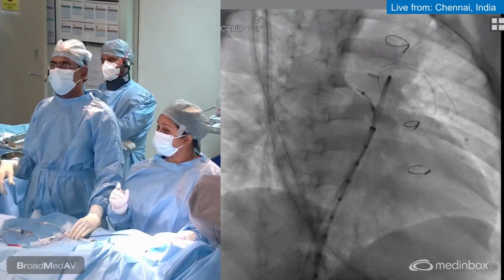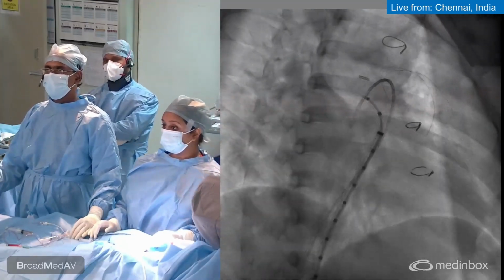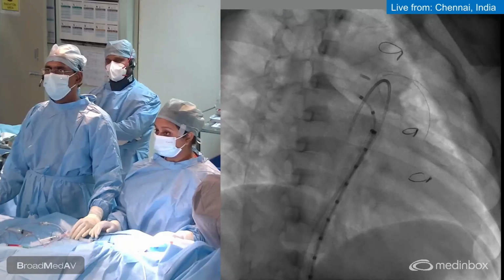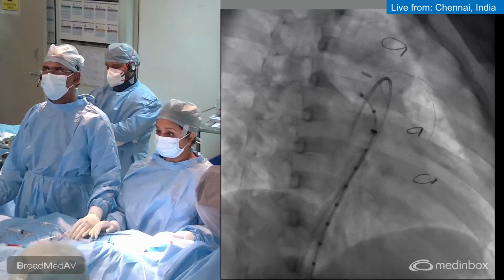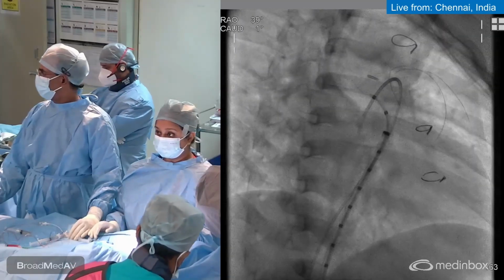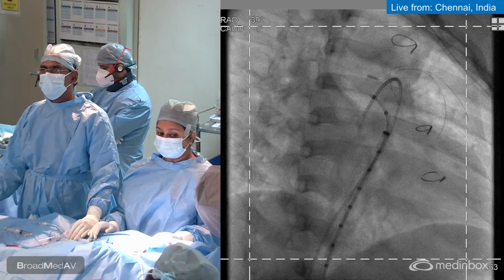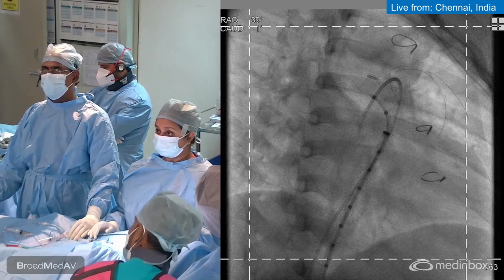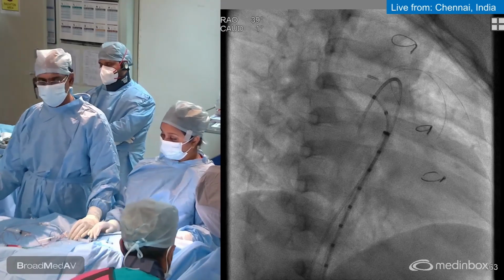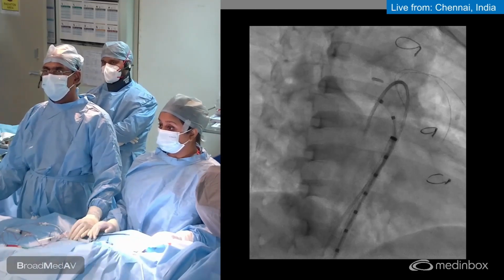The marker is there to guide us a little bit more. Yeah, that's enough. To collimate a little bit. Nicely collimate. So, what's the weight of this patient? 25. Yeah, 15 ml at 15 rate should be sufficient.